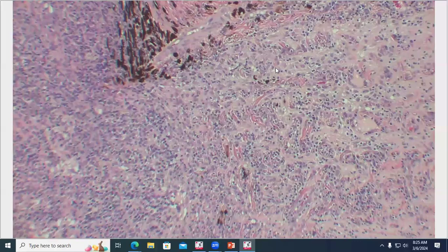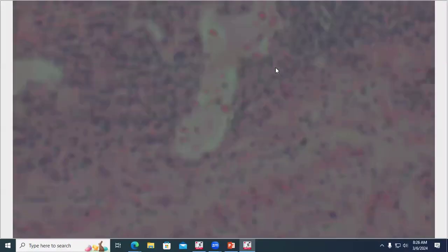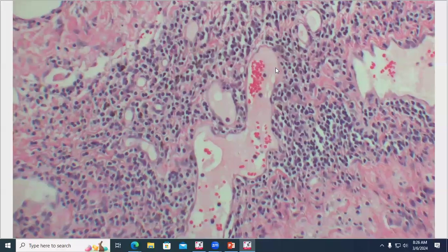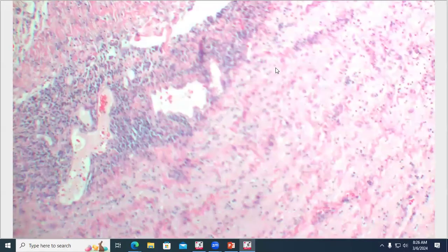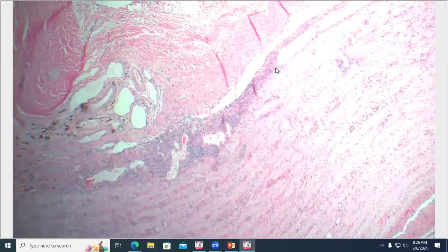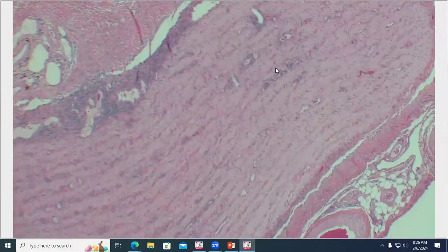We can see that it does infiltrate into the optic nerve here, and we've got some cells infiltrating into the meninges as well. It was a little difficult to definitively say that there are no neoplastic cells in here. They are a little bit on the smaller side, so maybe this is just an inflammatory component, but it makes margin assessment a little bit difficult, and I'm hesitant on whether this is truly a clean margin or not for this lymphoma.